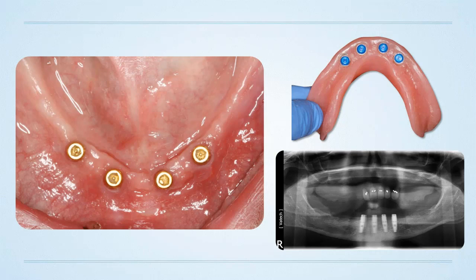And for some of my doctors that are listening to this presentation who say, well, I'm kind of new to surgery, yeah, this is a little bit more advanced. This is definitely a middle of the road application. You kind of have to feel a little bit comfortable with finding the mental foramen, dissecting down. If you don't feel comfortable and you still want to do this type of dentistry, get a surgical guide. Absolutely. Guided surgery is amazing. I love guided surgery. I do a lot of 3D printing in my own office.